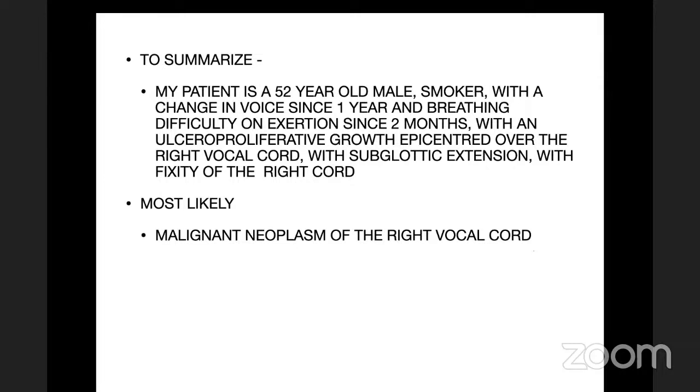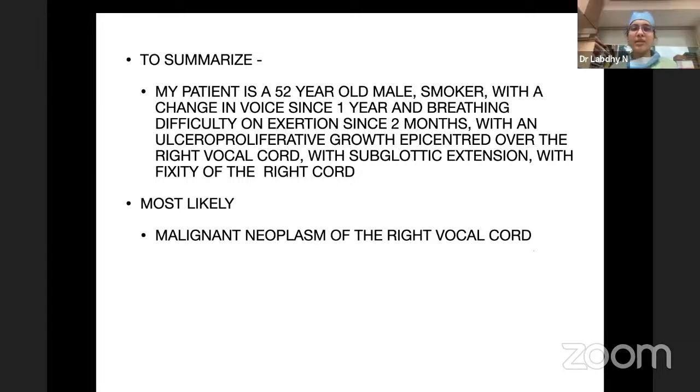Right. And what exactly in terms of extent of the disease will you be looking for in the CT scan? We look at the superior, inferior, and lateral extent of the disease: superiorly whether the base of the tongue is involved, inferiorly how much is the subglottic extension.